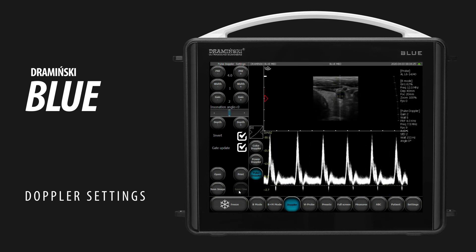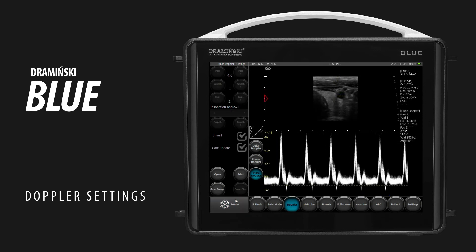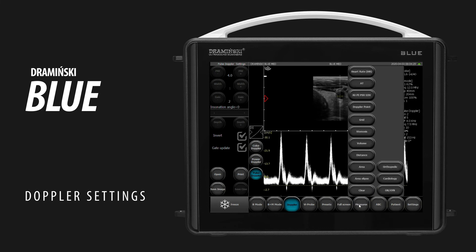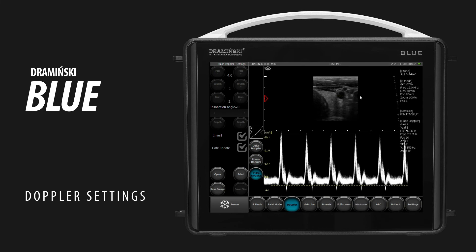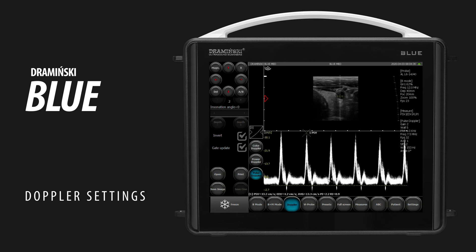To measure the resistive index, freeze an image, tap Measures, and choose the RI PI PSV EDV option. Put the measuring points on the spectrum. The result will be displayed below.